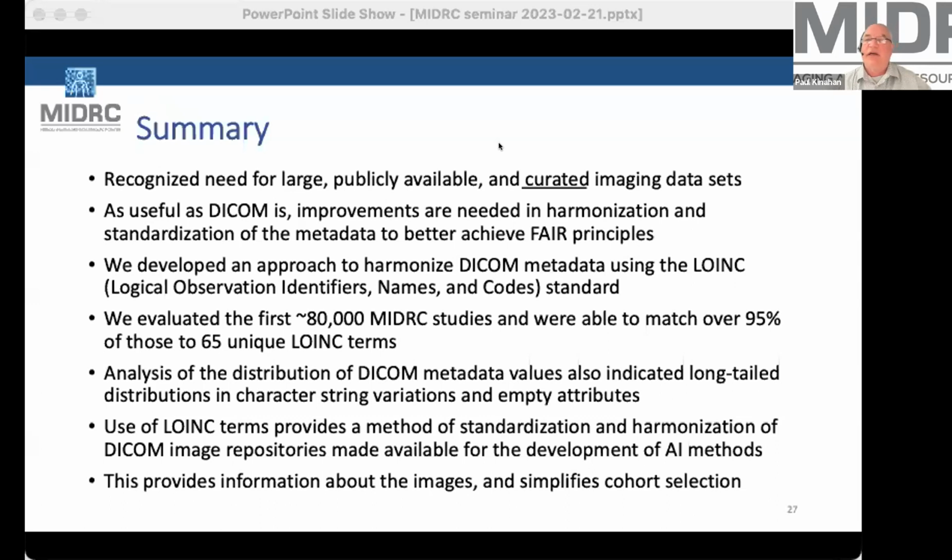It was on one of the slides I skipped over, but 20% of the images have been set aside, as well as developing methods for, if you're going to test an algorithm, what are the metrics you should be using? And the viewpoint is that later, if somebody is going to be using MIDRC to test algorithms and potentially taking it to the FDA, they're being given some guidance about what are the appropriate tests and what data they should be using and things like that.